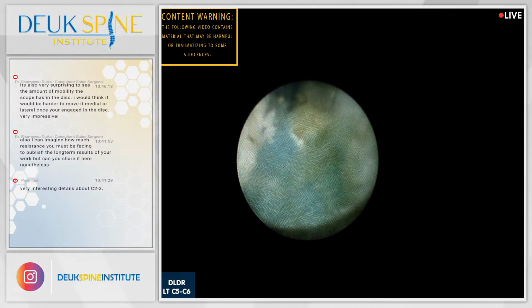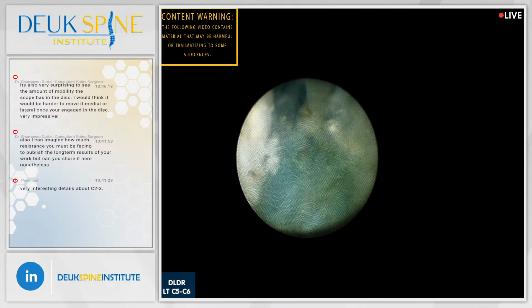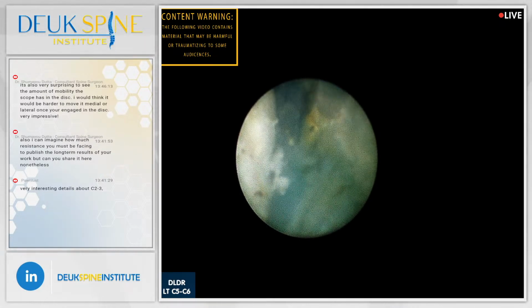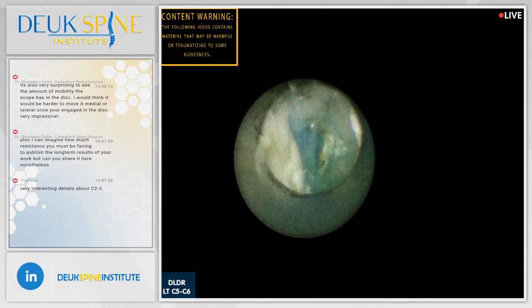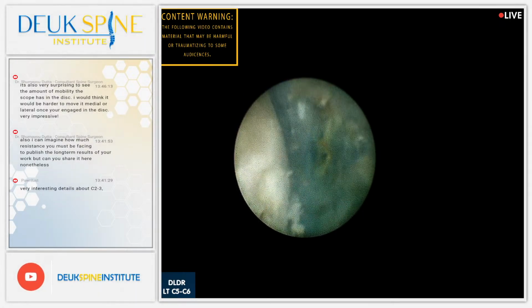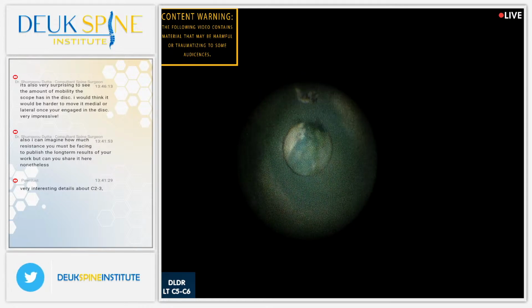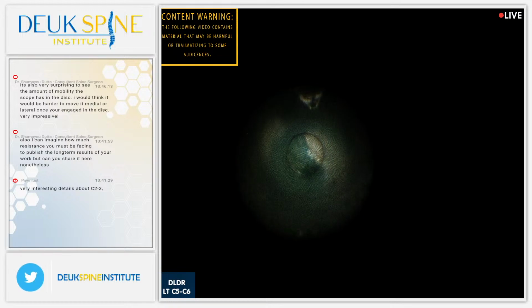This is both ligament and herniated disc and scar tissue from chronic inflammation and calcification. You see the calcium there is the gold color, but basically the nerve root is going to be just there at the tip of the laser, and I'm going to go look for some more herniation pieces. We've already taken out about 15.